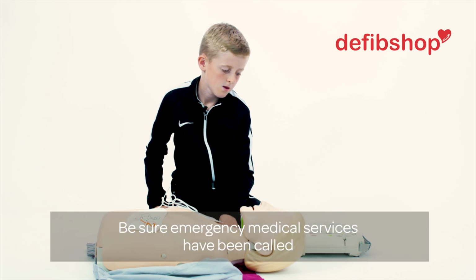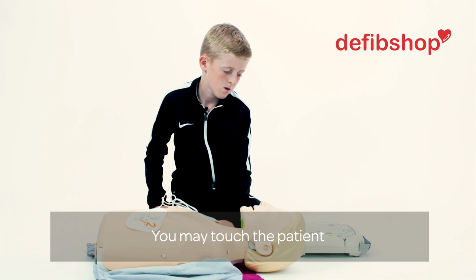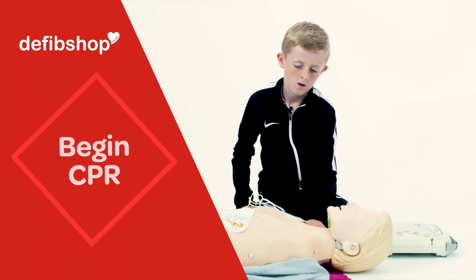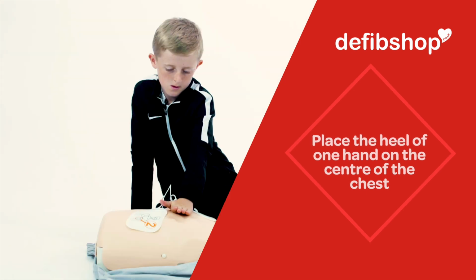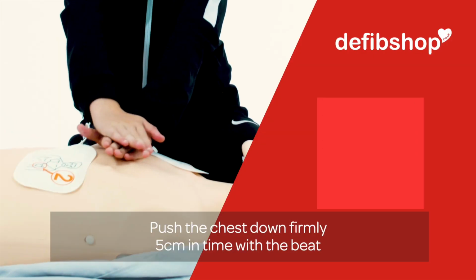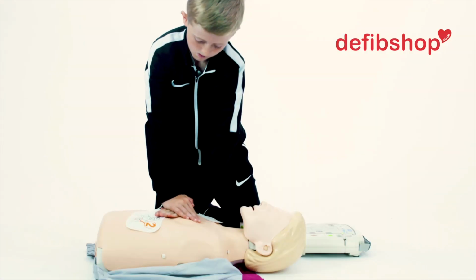Be sure emergency medical services have been called. You may touch the patient. Begin CPR now. Place the heel of one hand on the centre of the chest between the nipples. Place the heel of your other hand on top of the first. Push the chest down firmly 5 centimetres in time with the beat.